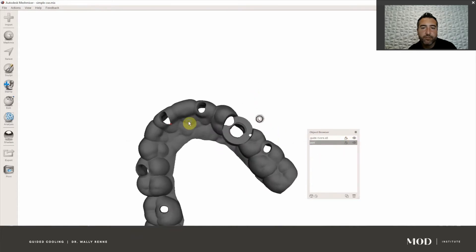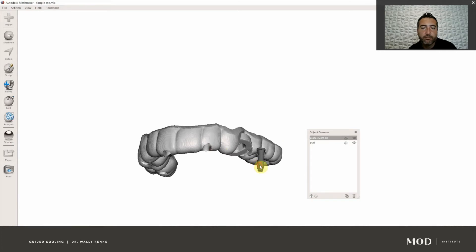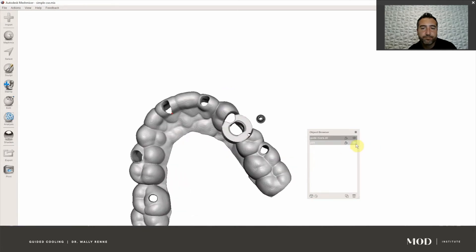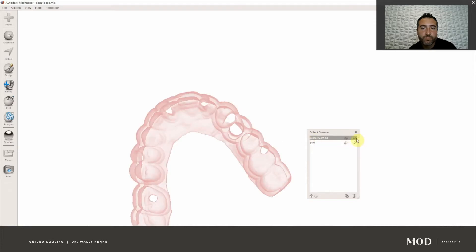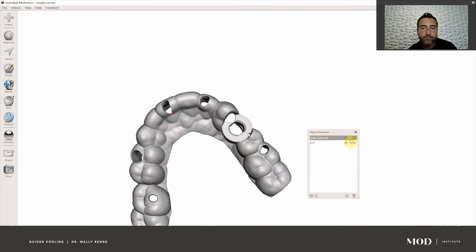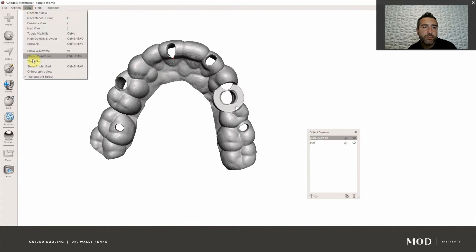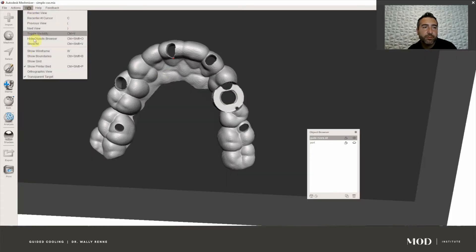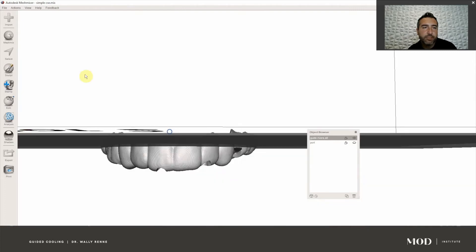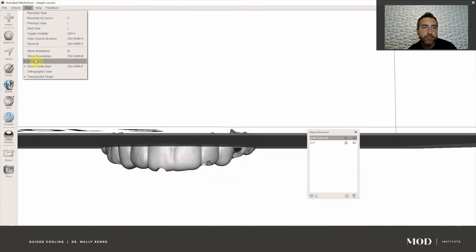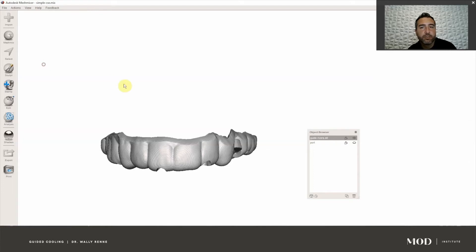Here we have two objects: we have the port and the guide. Lastly, go to View and make sure you don't have your printer bed showing, your grid, or any other distracting objects. Go to View and toggle those off by clicking the checkmark.